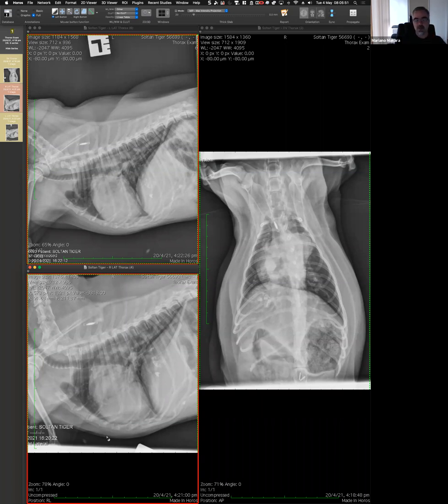Anyway, this is just thinking aloud, sharing what I do. That doesn't mean that it is the way to do it, or that it is correct. What I realize after doing this for years is that once you have that information, you cannot get rid of it. So you are at a disadvantage, because that information is biasing you a lot. Anyway, I'm all ears, and I have my little paper here, and I'm going to be taking notes about the findings.